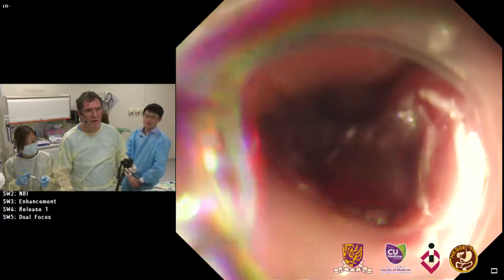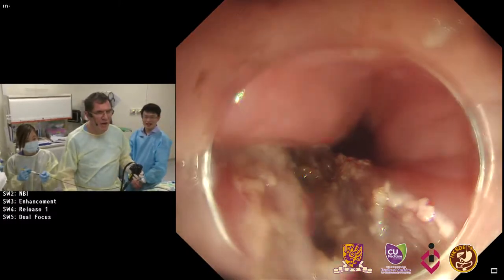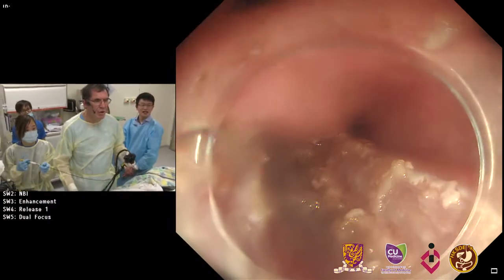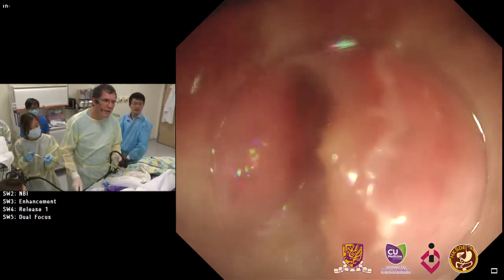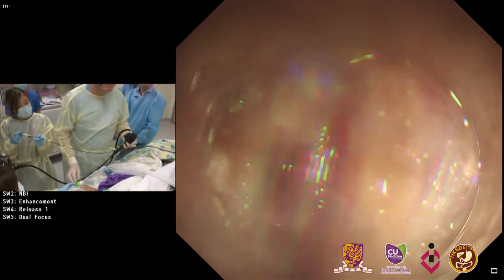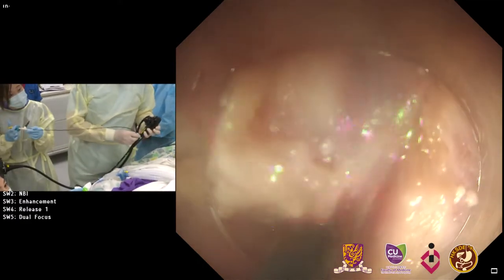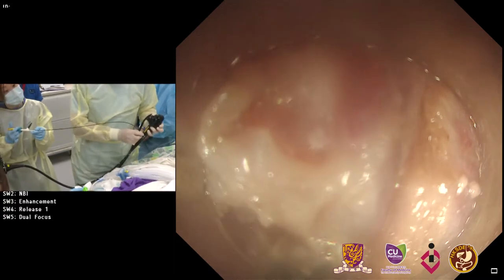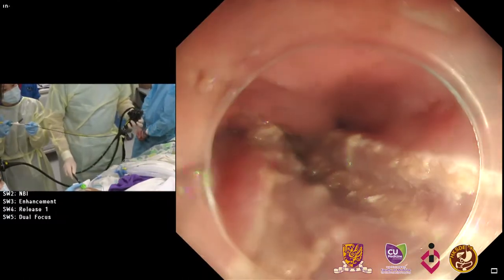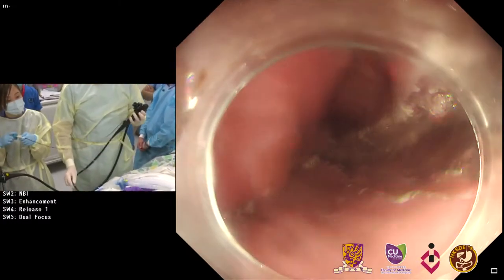I have already finished. The diverticulum is really huge — this is the septum which I cut. Here is the esophagus, and there's almost just a small edge left, so I won't go deeper. Maybe just a few fibers. Then I'll put some clips on it. Let's check again — I think the patient should definitely improve with his symptoms. This is now the final result and I think we can stop here.